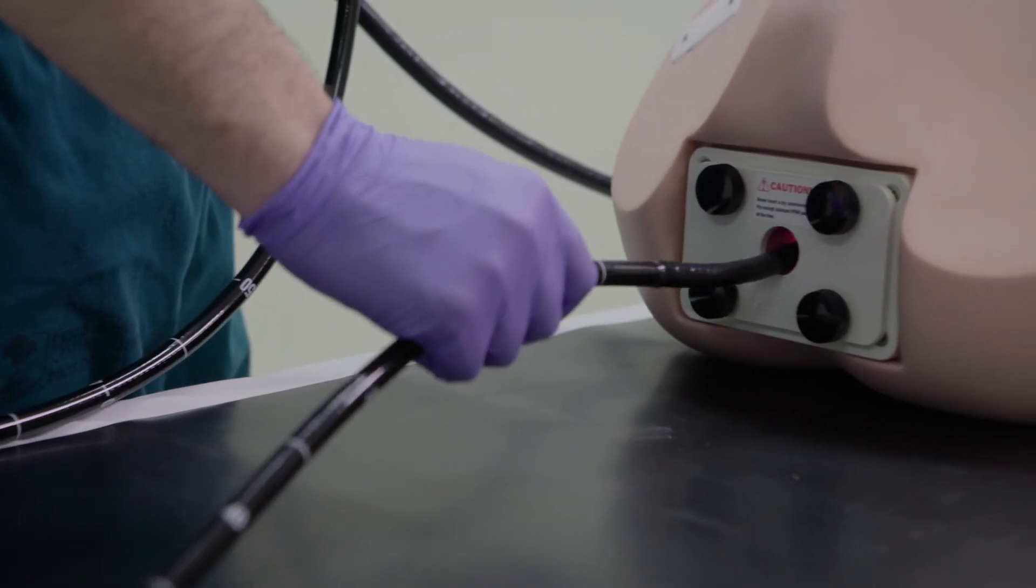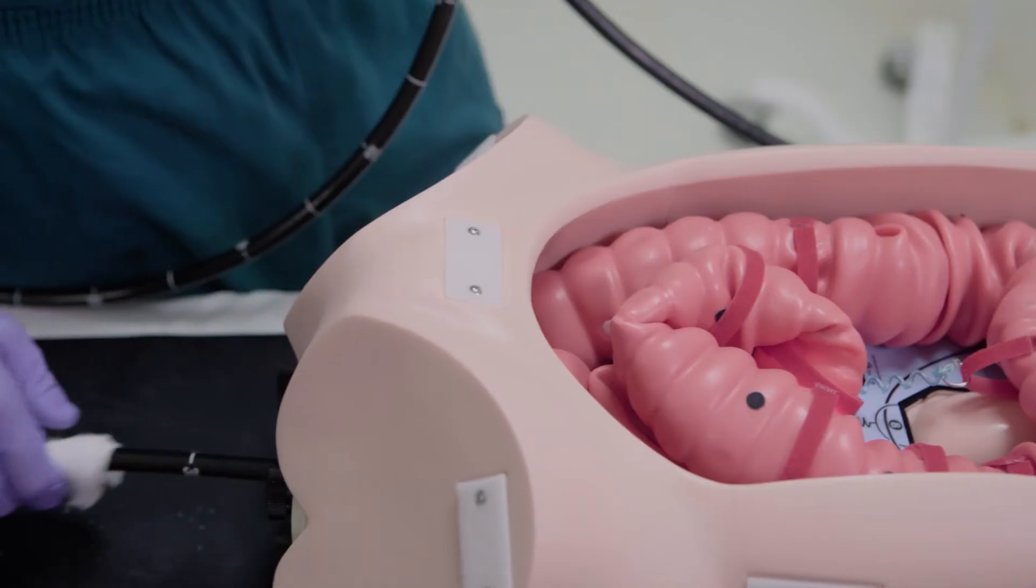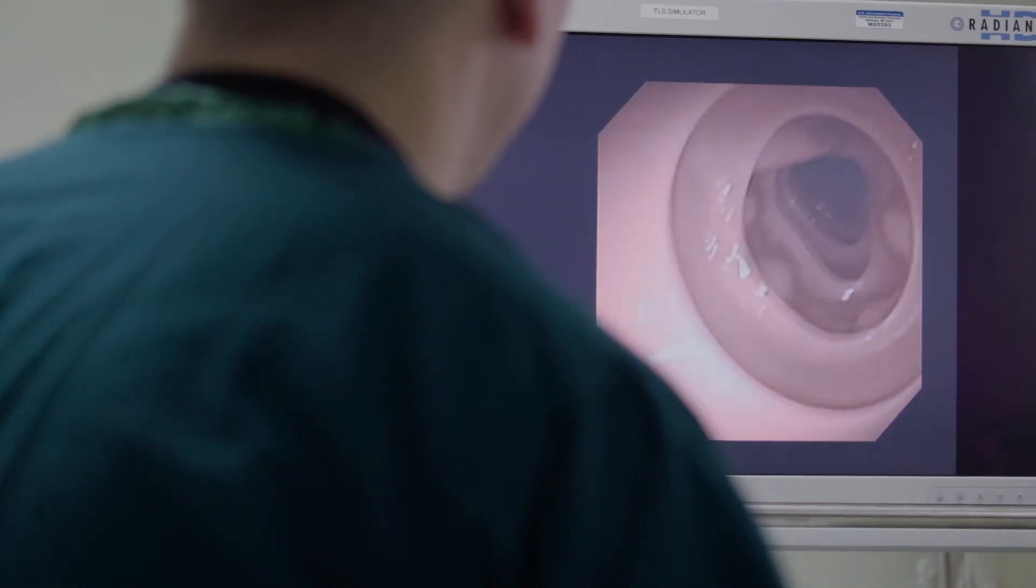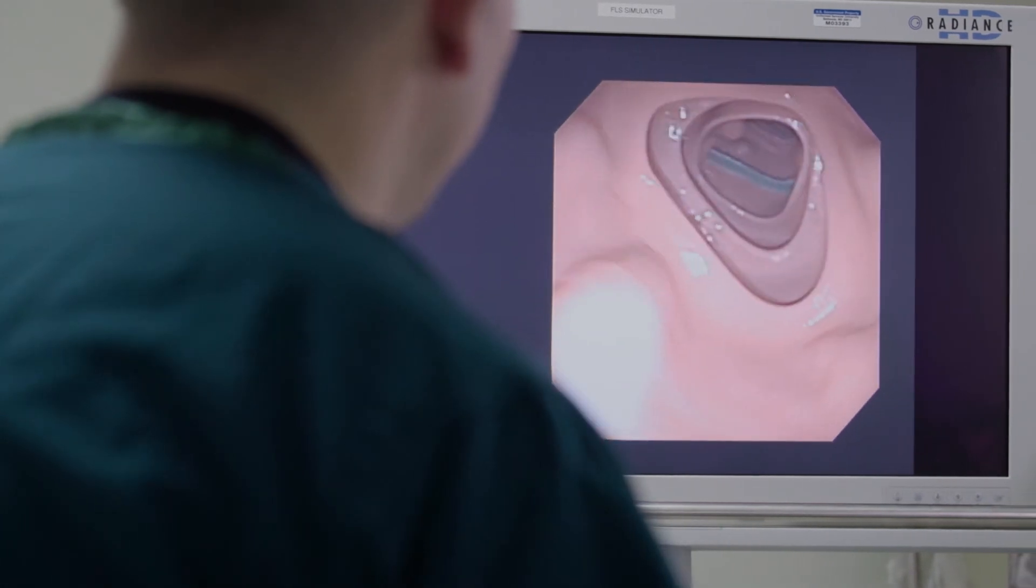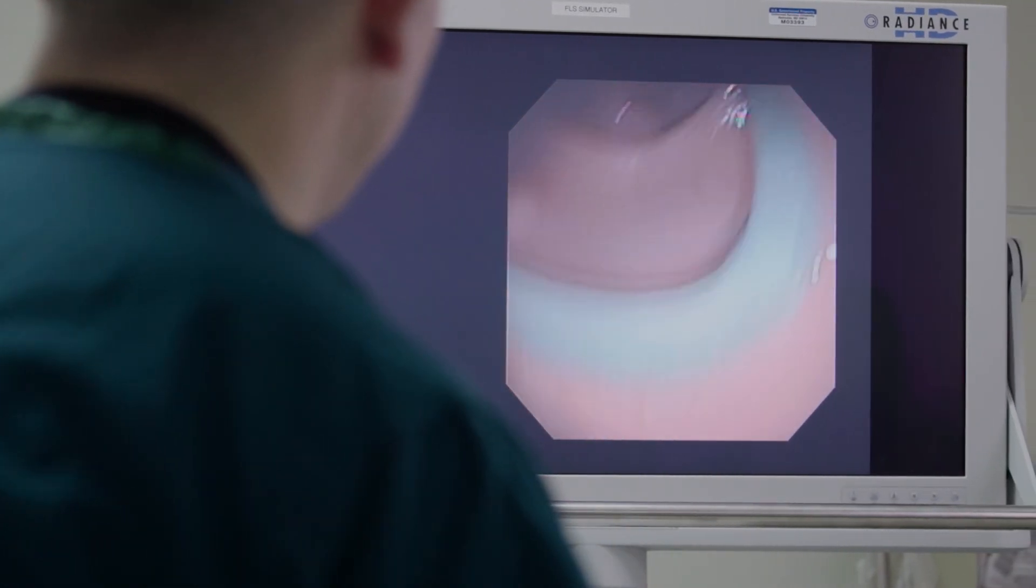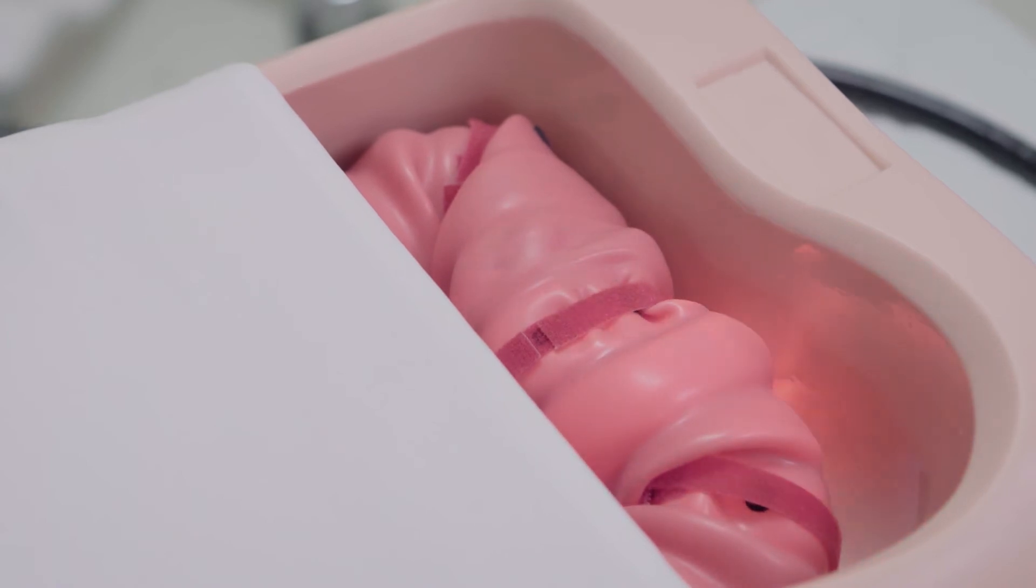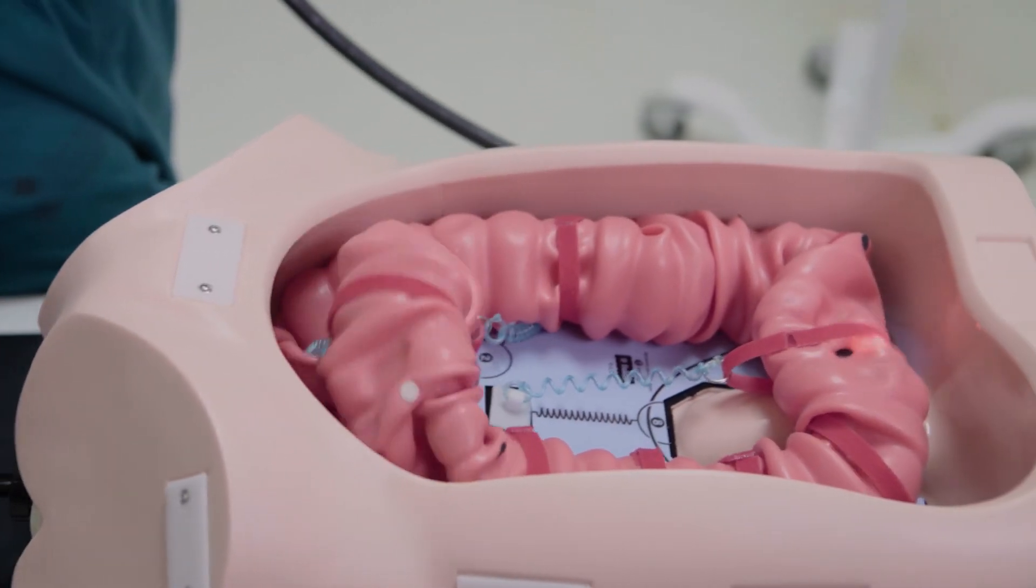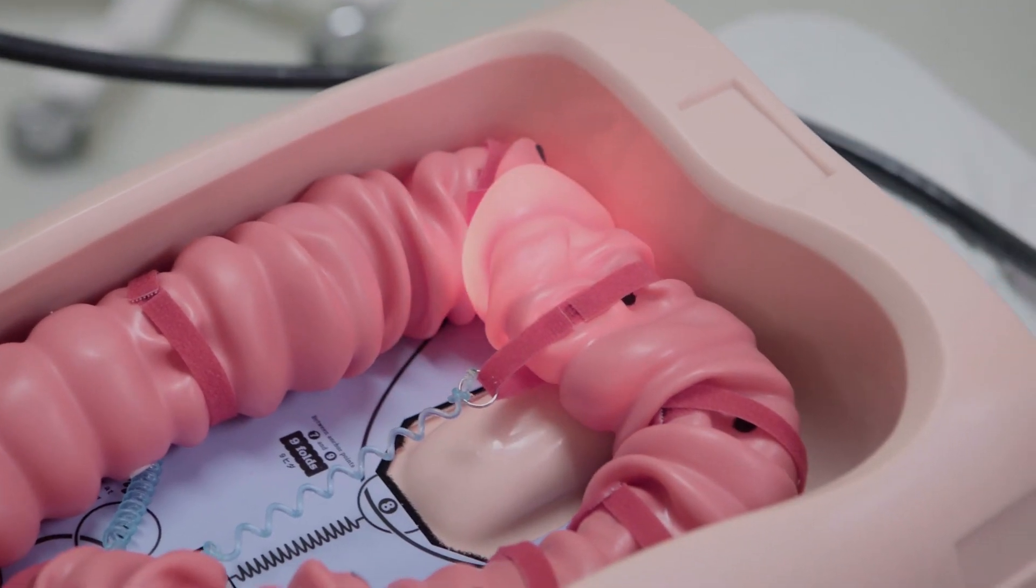Here the trainee navigates the endoscope to manage the correct reduction of a standard alpha loop. The trainee first navigates into the reduction zone, identified by the lines within the lumen and the visualization of light in the exposed portion of the transverse colon. The trainee must then recognize and successfully reduce the loop to continue advancing the colonoscope.